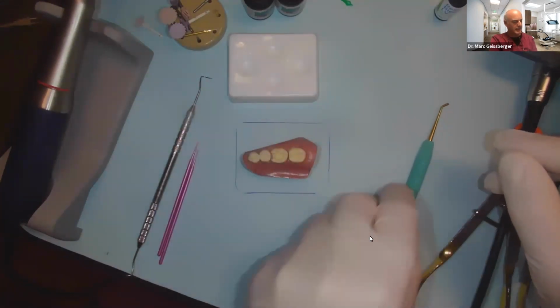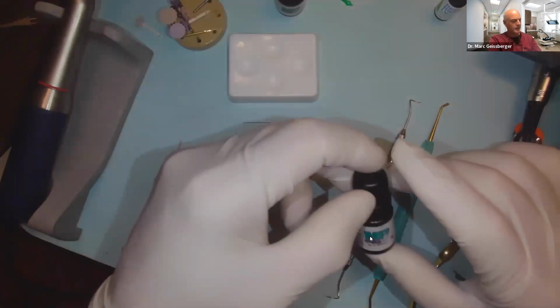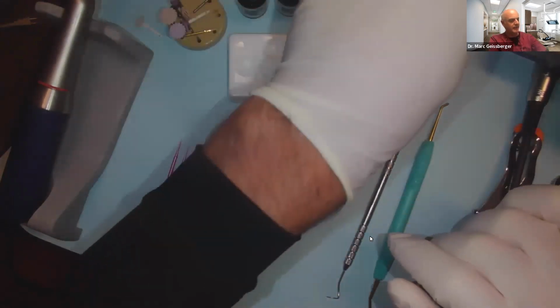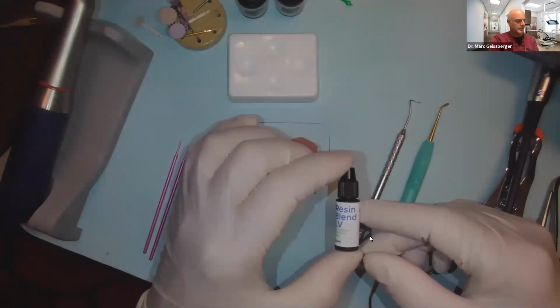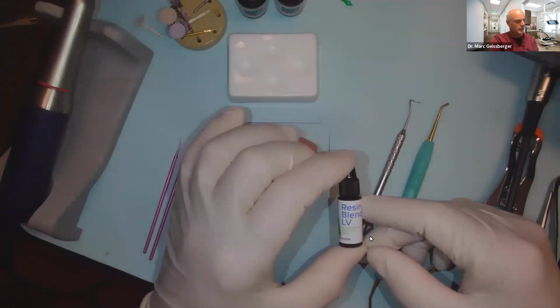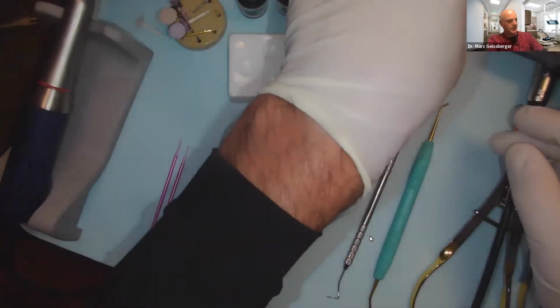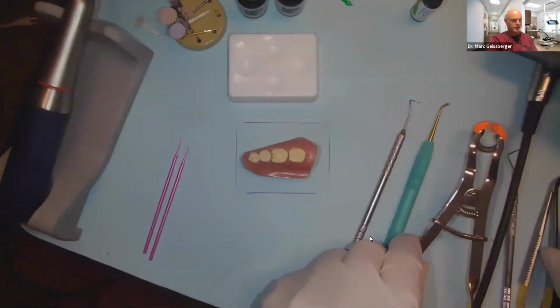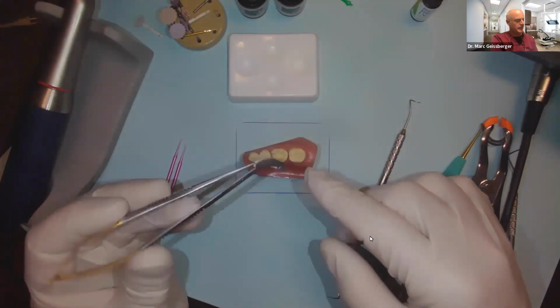Now, in addition to that, I have a Pigtail Explorer, some micro brushes for the application of my MPA Max bonding agent. In addition to that, I have a product that I didn't mention in the lecture called Resin Blend. Now, Resin Blend is a liquid blending agent that works really well when you're trying to smooth off your anatomy and get that to go. In addition to that, I have my dual force ring on its forceps. I have Clinician's Choice little tweezers to help me pick up my sectional matrix band.